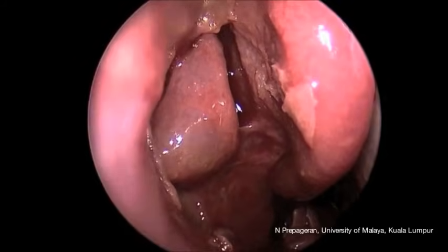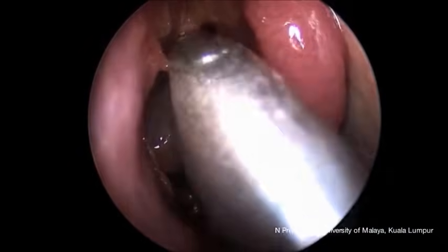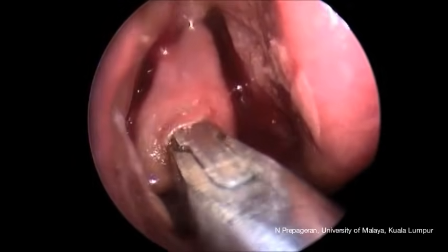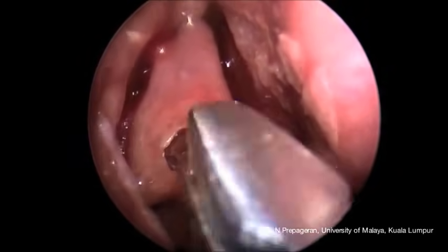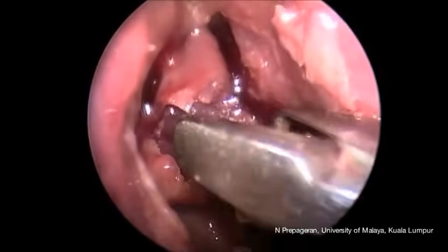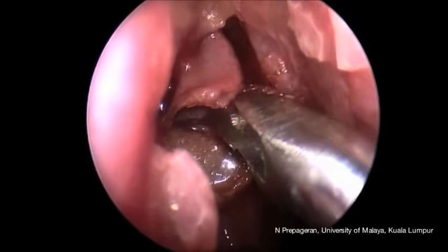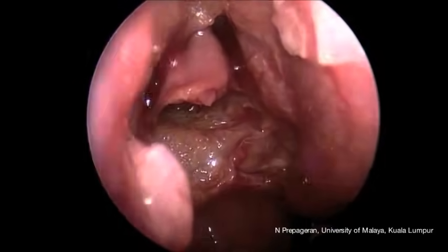Where the middle turbinate moves and laterally attaches itself is the ground lamella, which is the boundary between the anterior and posterior ethmoids. The first thing we need to do before an ethmoidectomy is to make sure there's an air cell — air cells are always our friend. Using an instrument we can puncture the belly of the bulla ethmoidalis itself, confirming there's an air cell. Once we know there's an air cell, we can use any instrument — powered debrider or forceps — to remove and open up the cells in the anterior ethmoid or bulla ethmoidalis.